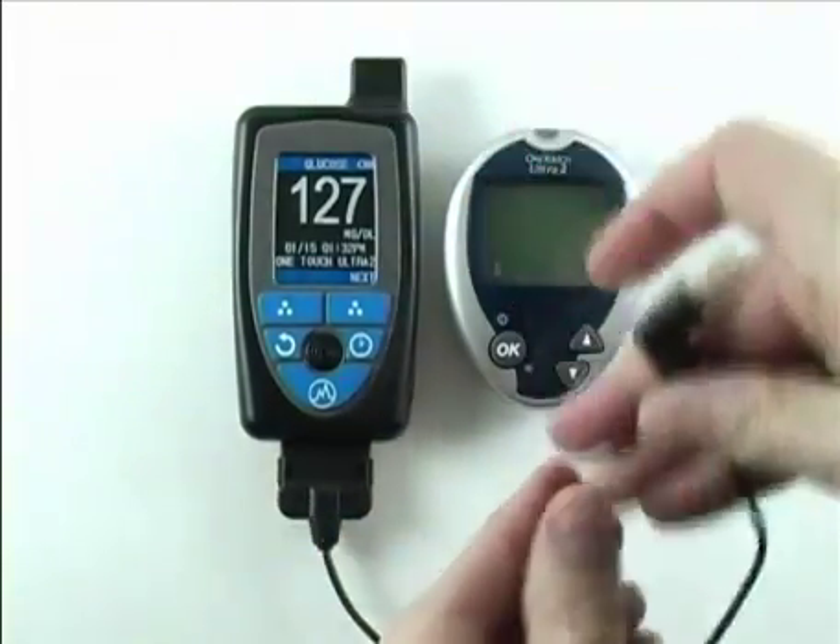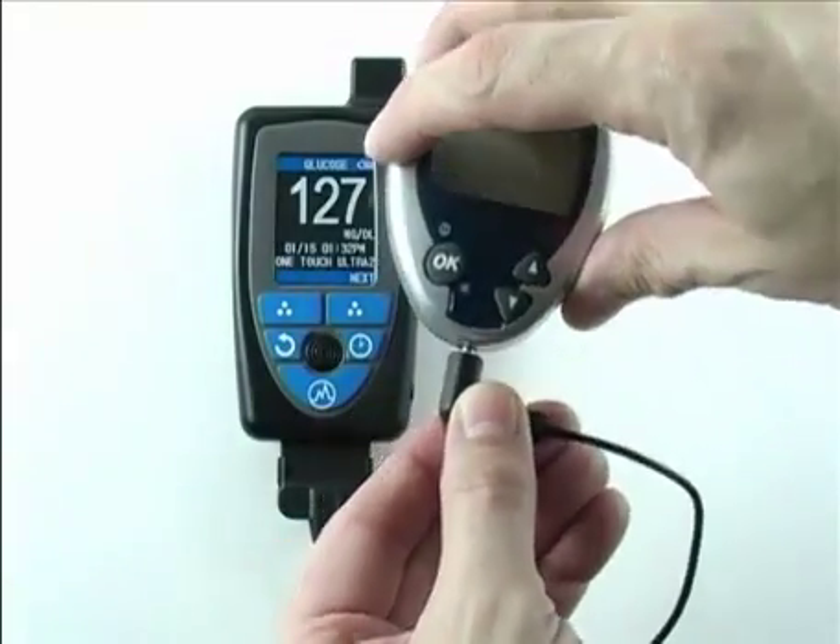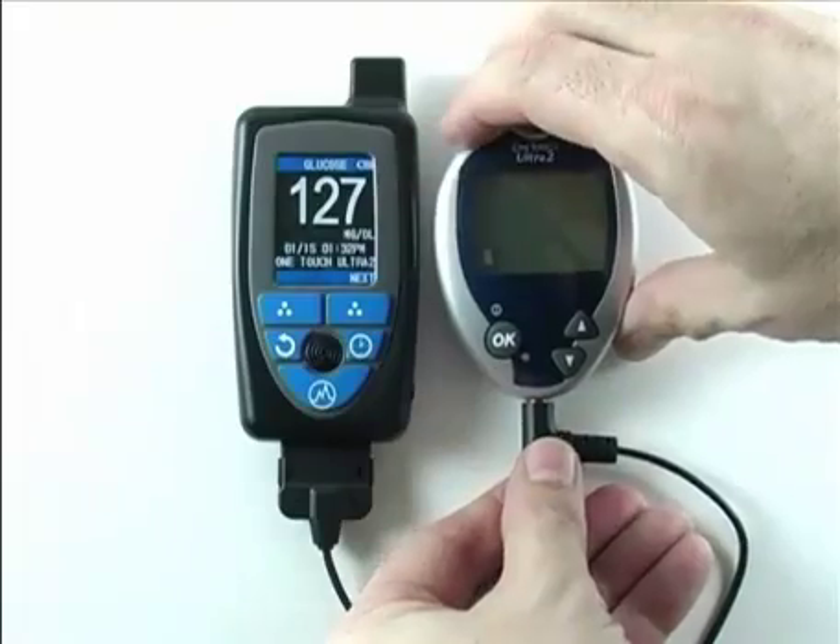It is very simple to connect — just attach the smart cable's 30-pin connector to the HealthPal and insert the other end into the data port of the glucose meter like so.